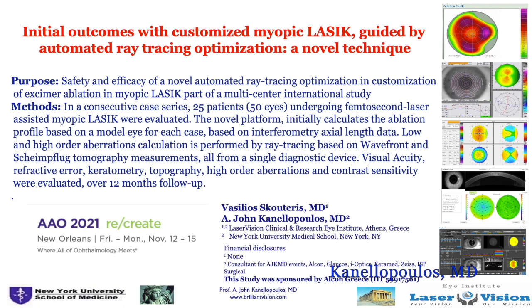number 59917561 from Alcon, Greece. And we looked in the study at the safety and efficacy of using this new ray tracing platform to customize myopic LASIK eyes. To note here that this technology does carry a CE mark since the fall of 2019. In this particular study, we chose to study 25 consecutive patients, 50 eyes that were treated with femtosecond laser-assisted LASIK using the FS200 femtosecond laser and the EX500 excimer laser by Wavelight Alcon.